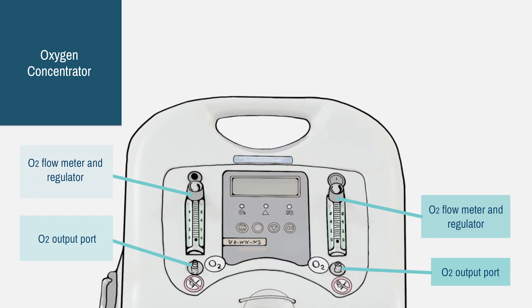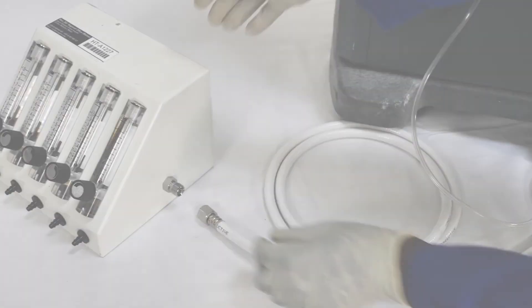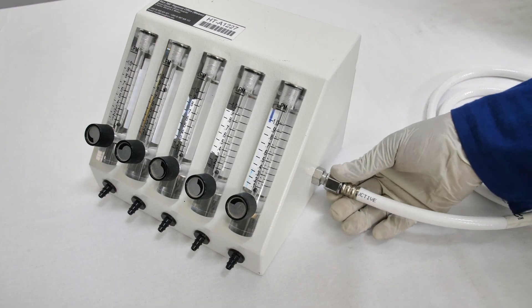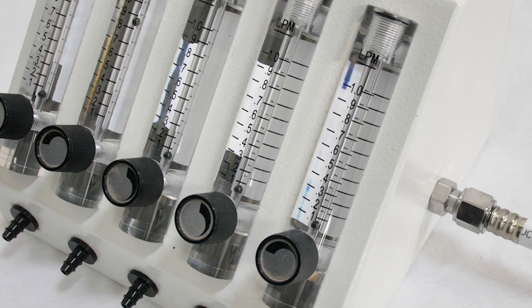Finally, here once again are the parts of the concentrator. You can use either of the outlet ports to connect directly to a flow splitter or a CPAP device, or directly to a patient. Unlike some other models, the ports do not have an internal valve, and so oxygen will start to flow as soon as you open the flow meter. Ideally, when delivering oxygen to babies, you will be using a flow splitter, because it is much easier to accurately calibrate the very small doses needed. The flow meters on this model go from 0 to 1 liter per minute, rather than on the concentrator where it goes from 0 to 8 liters per minute.